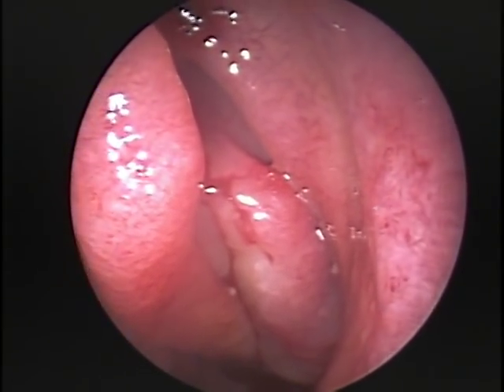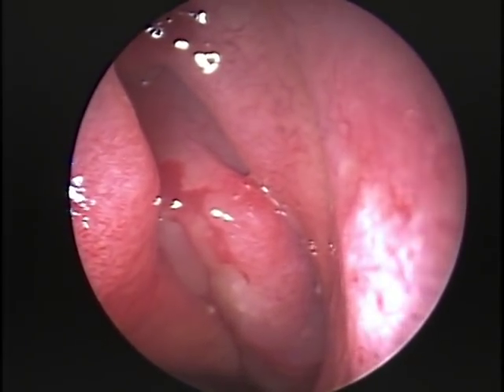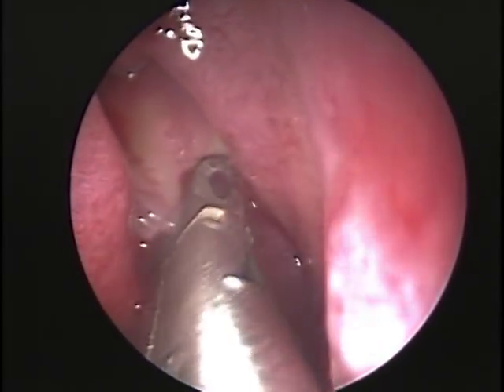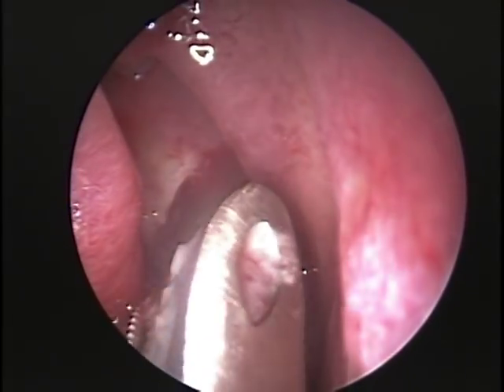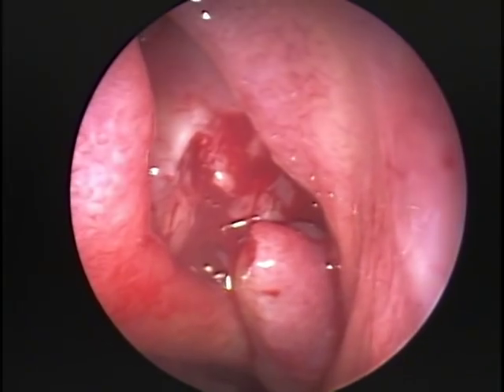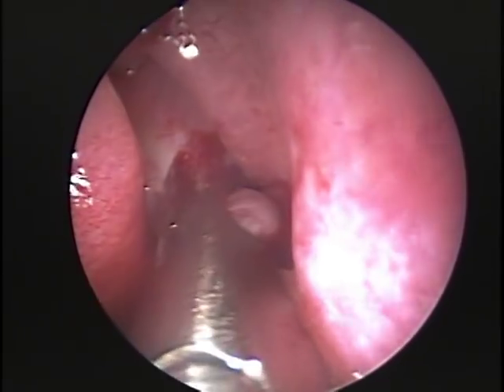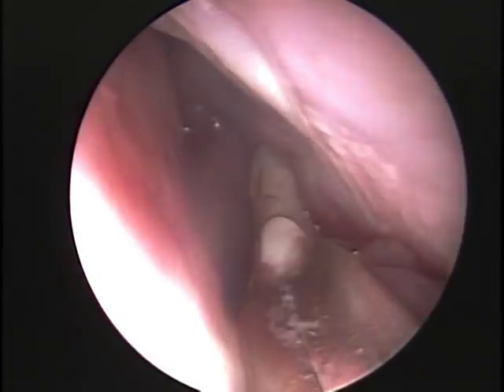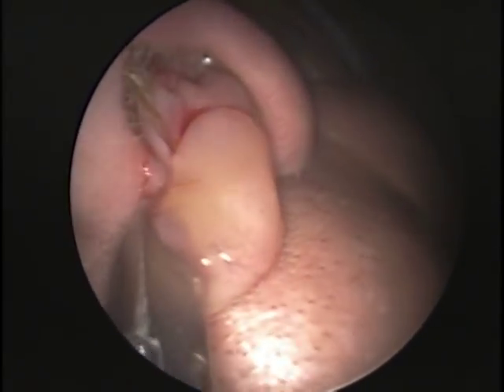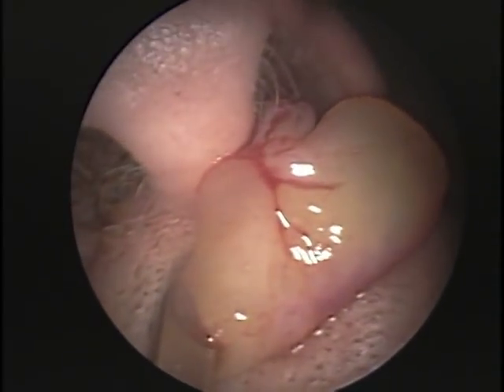Using through-cutting forceps we will divide the stalk, and then using large straight cups I will grab the polyp at its stalk and pull it out of the nasal cavity. And here is our choanal polyp — a record short polypectomy.